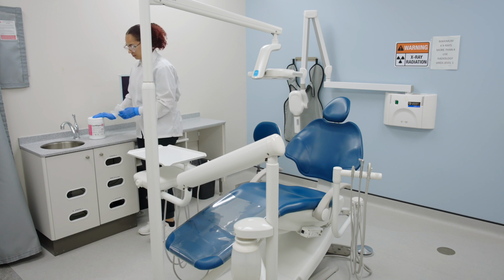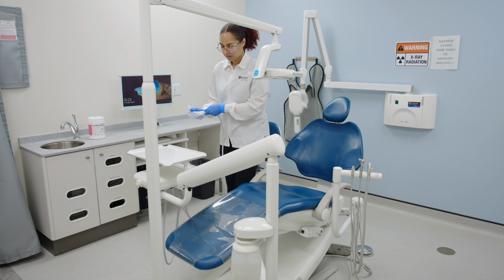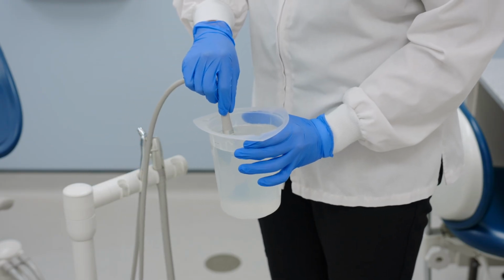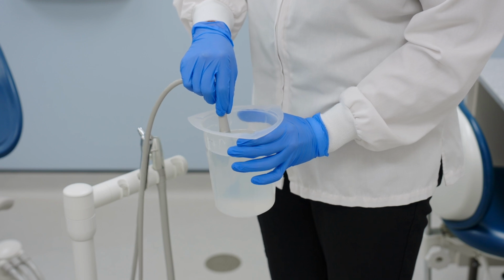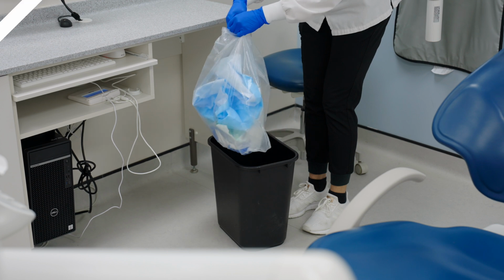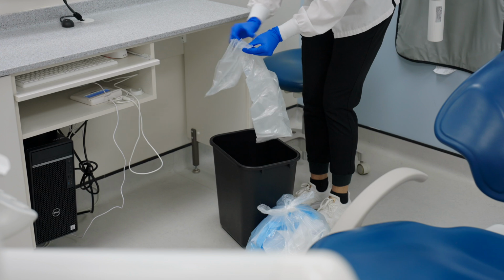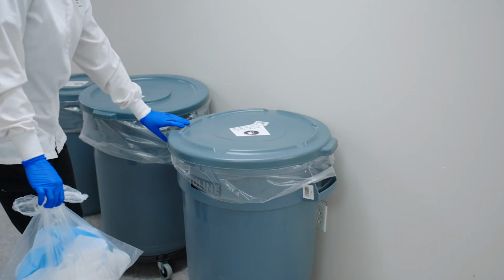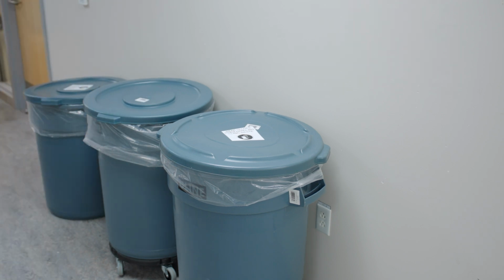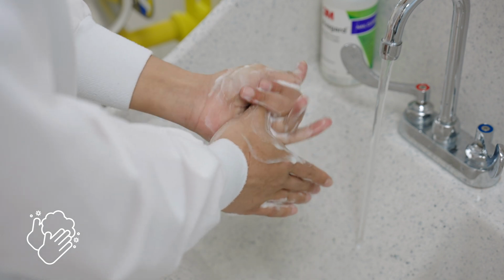At the end of each appointment, all suction lines are cleaned using the same method as before, with a solution of Nutravac or Microvac and water. Once cubicle disinfection is complete, with gloved hands, remove the garbage bag and tie off. Replacement bags are located at the bottom of the trash can. Place a new garbage bag in the trash can and take the tied off cubicle garbage bag to the main clinic trash. Doff gloves. Proceed to the designated hand washing station and perform hand hygiene.